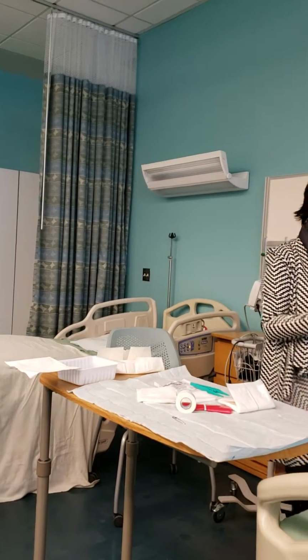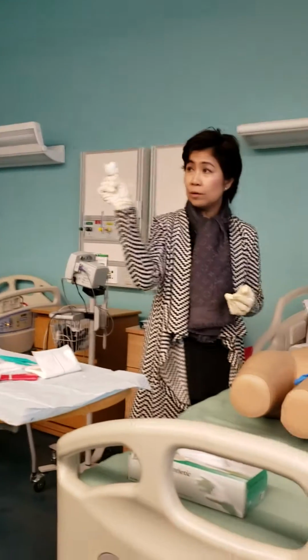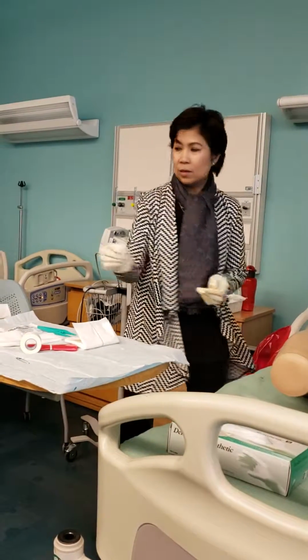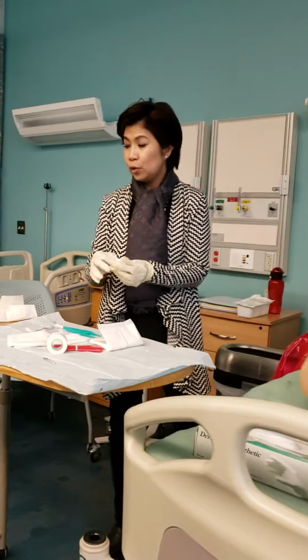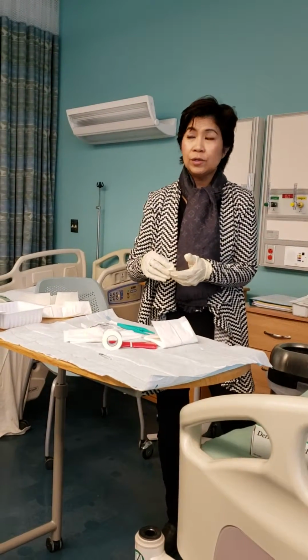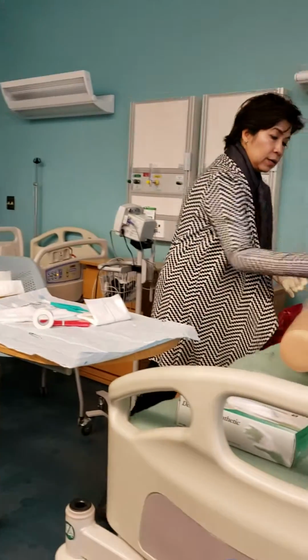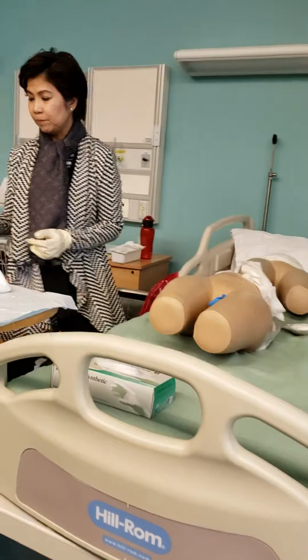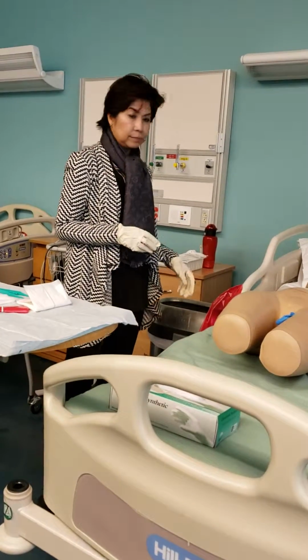Remember, everything here is sterile. Then the same thing as the swab stick: clean, discard, and then get another gauze. You usually have lots of gauze soaked there. Clean and then discard.